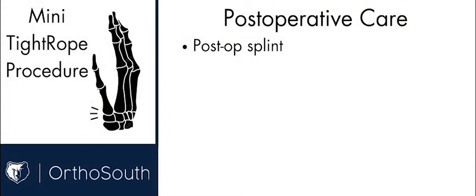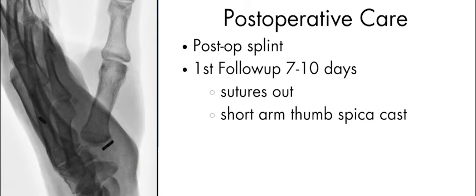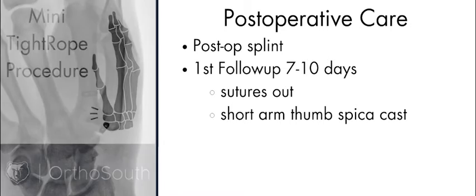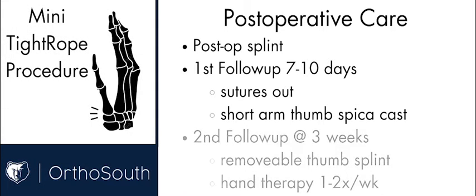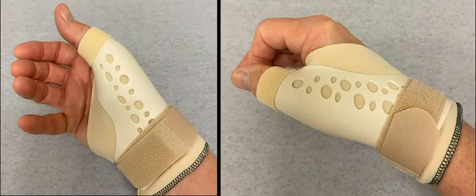The patient is placed in a well-padded half cast or splint the day of surgery. They return to the office at 7 to 10 days for suture removal, X-rays, and placement in a thumb spica cast. This is left in place for 2 weeks. At 3 weeks total, the patient returns for conversion to a hand-based splint and initiation of hand therapy.